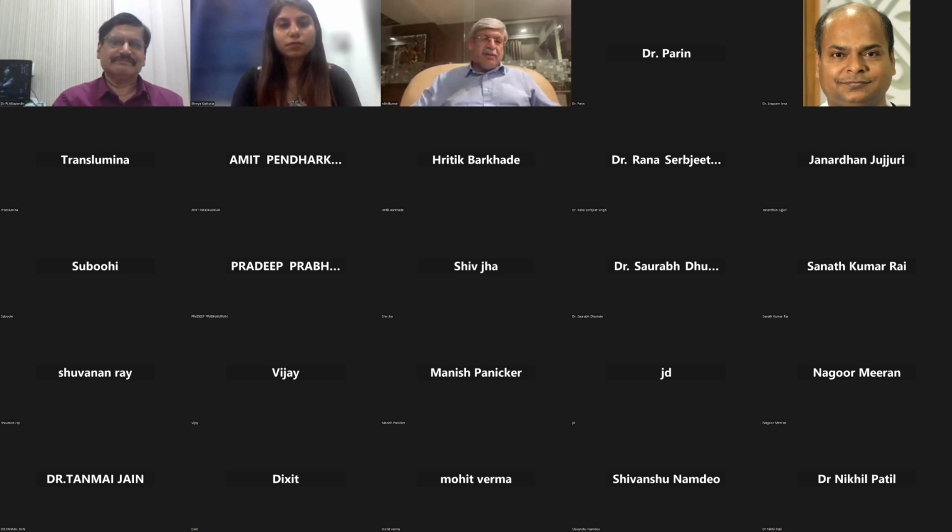But here, like you said, we have a very straight segment, balloon expandable. The problem happens when it's a very tight lesion. It's one of those 90-95% long segment lesions where you have difficulty in passing very small balloons. In that case, one would prefer a rotablation. But I think this was a very good case presentation for an IVL post-stent.